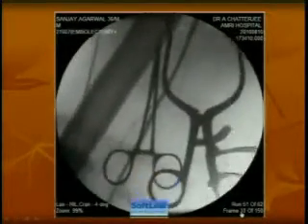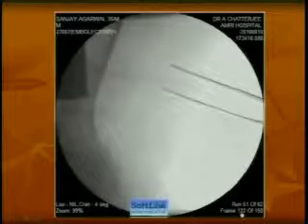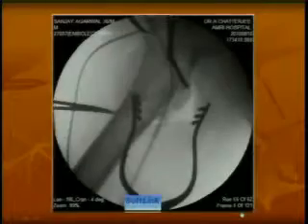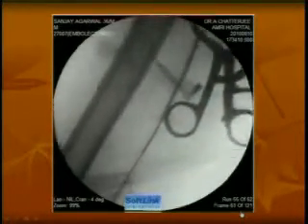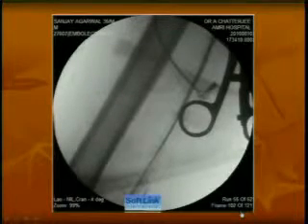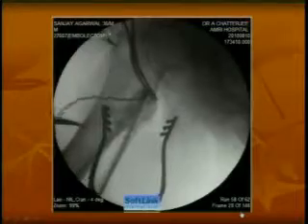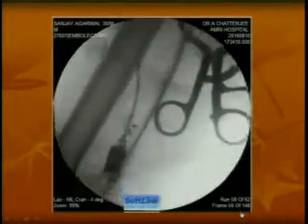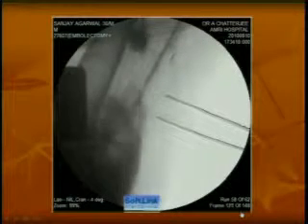So now I started my procedure down through the endarterectomy channel, flow half through. This is approximately my target just above the knee. I want to restitute the circulation up to there. Then after another bout of dilatation, slightly better, still not going down fully. This is after some repeated dilatations, we have got down to the target lesion just above the knee.